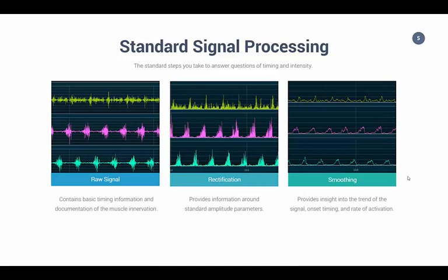Typically, these noise frequencies are occurring below that 50 Hz or above that 150 Hz level, and may be caused by such things as motion artifact or even infiltration of other electromagnetic signals from different wireless devices.